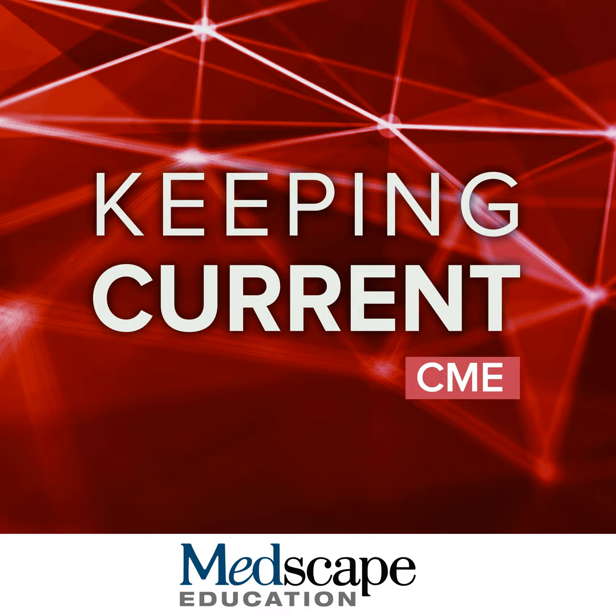And it turns out we can actually make that assessment because we can look at what's called functional liver imaging score, or FLIS, and it's actually composed of 3 parts, and it's very easy to calculate. First, we're going to look at enhancement of liver as opposed to the kidney. We're going to assign a score of 0 if the liver parenchyma is less enhancing, score of 1 if it's iso-enhancing, and then score of 2 if parenchyma is hyper-enhancing to kidney.